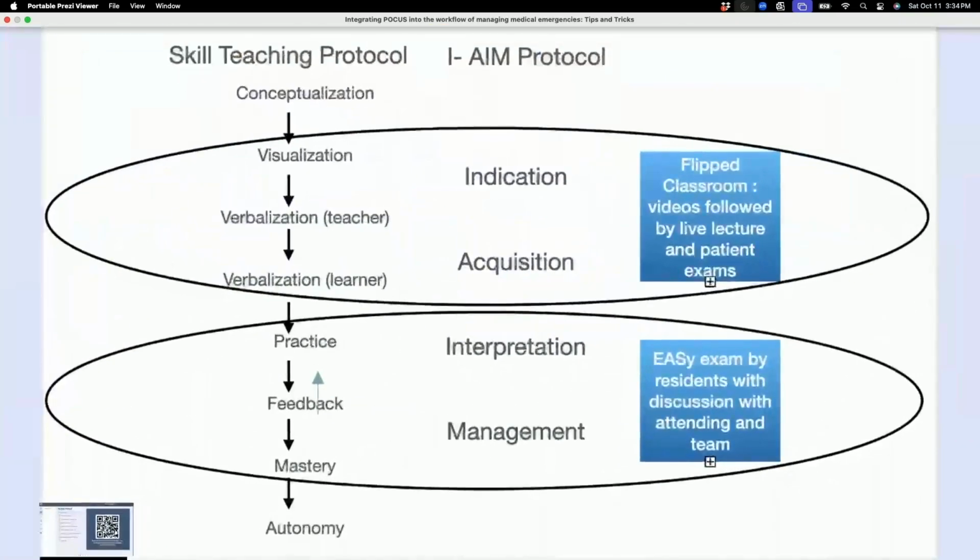So again, we separated the image acquisition from image interpretation. During the entire month, while we're rounding the ICU, we talk about the interpretation for all these different images, and we utilize the phenotype cards to help.